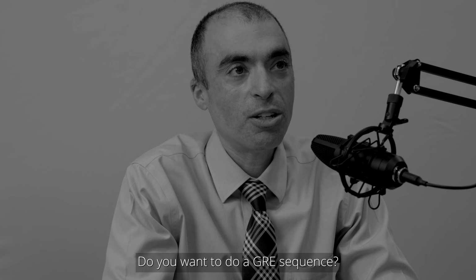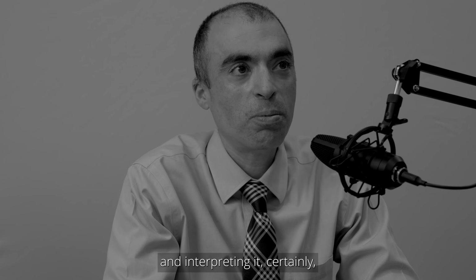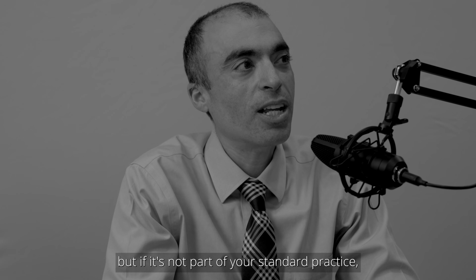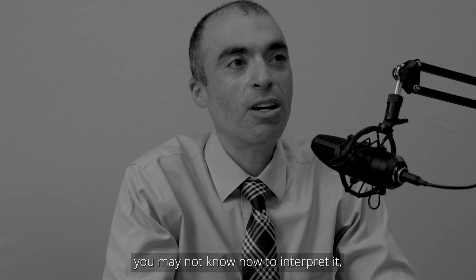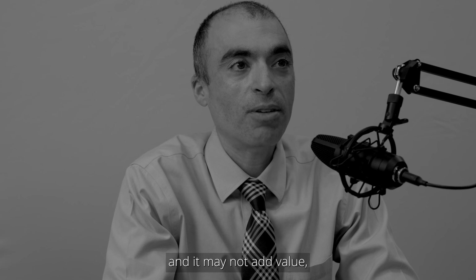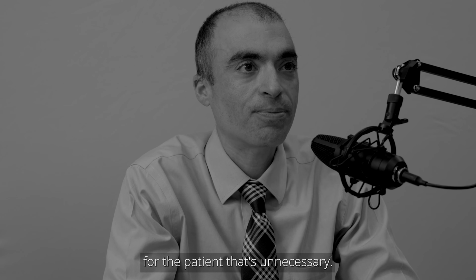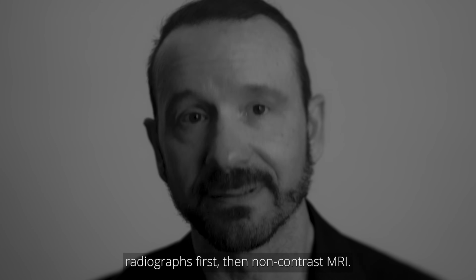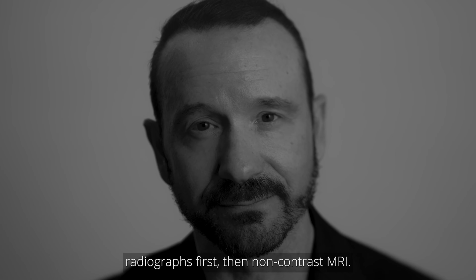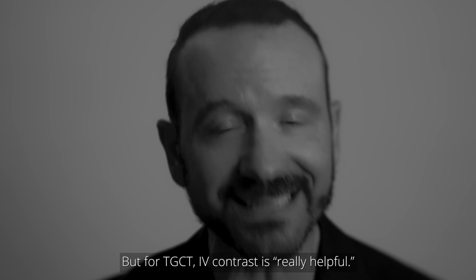Do you want to do a GRE sequence? If you feel comfortable looking at it and interpreting it, certainly. But if it's not part of your standard practice, you may not know how to interpret it, and it may not add value, and you're just adding unnecessary extra imaging time for the patient. Standard MSK imaging, radiographs first, then non-contrast MRI, is fine for 99% of cases, but for TGCT, IV contrast is really helpful.